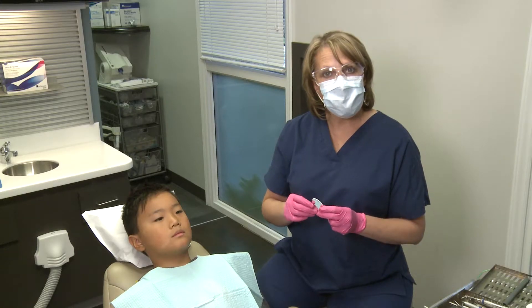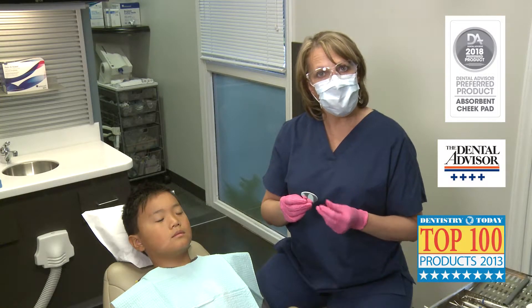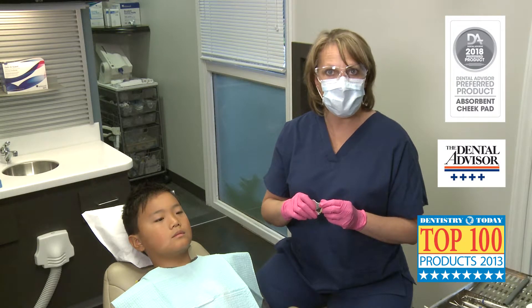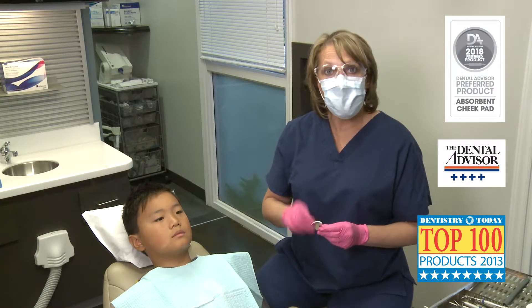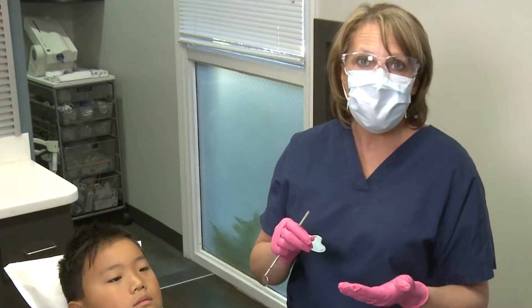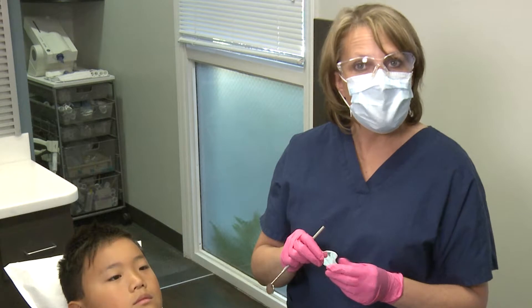The Reflective Shield Plus, which are a dental advisor's preferred product and a Dentistry Today's Top 100 Products winner, are so absorbent that one shield will absorb for the entire procedure. Saliva must be kept at bay in order to maintain a dry feel.